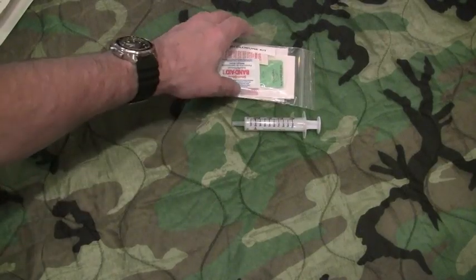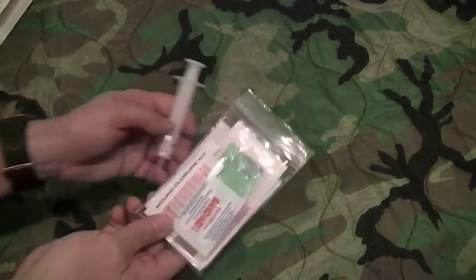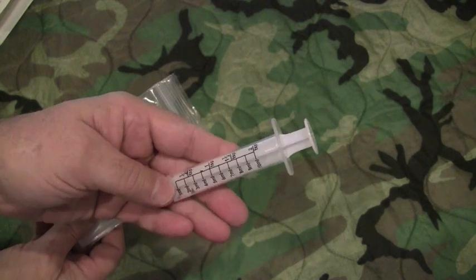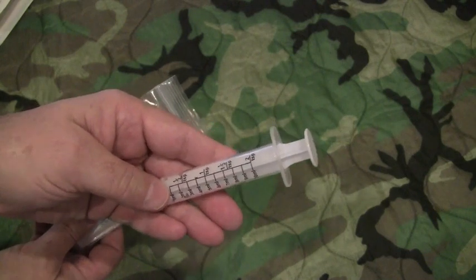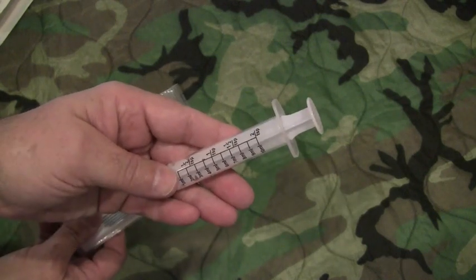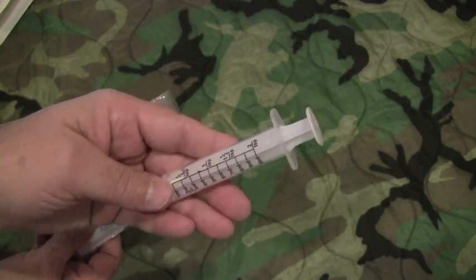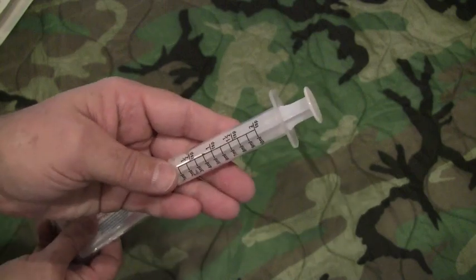Okay, we're down to the wound management kit. This is the 10 cc syringe that you use for irrigating the wound. Again, that's the best management for taking care of a wound, is copious irrigation under pressure with clean water.